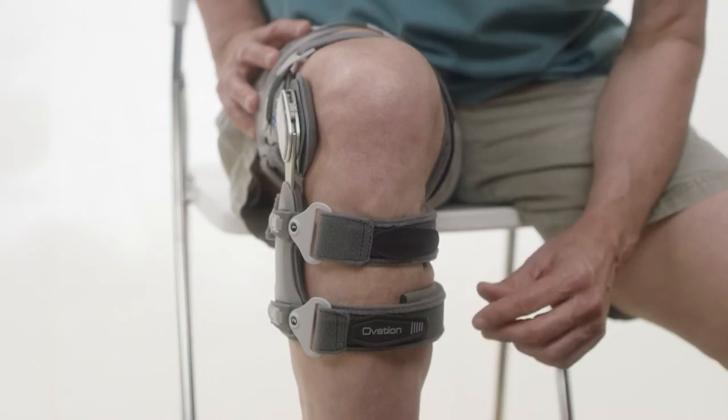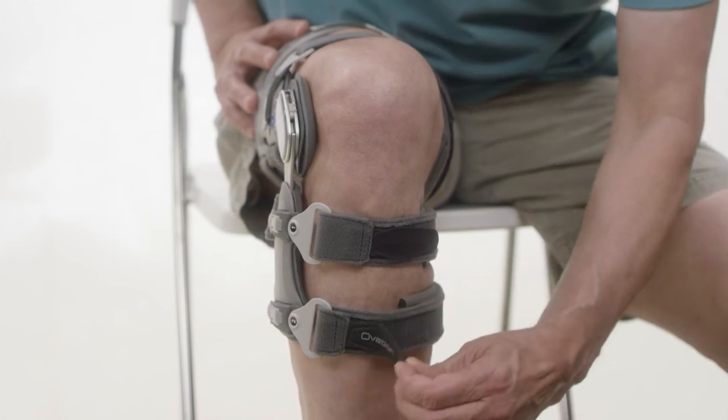Step 4: Final adjustment. Verify proper hinge alignment, then adjust strap tabs.